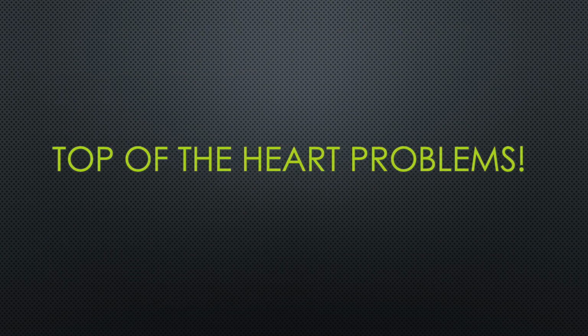All right, so we've talked about most of the normal and the sinus rhythms, so let's start talking about the difference between a top of the heart problem and a bottom of the heart problem. Remember that when we're looking at a rhythm, there are P waves and then there are QRSs. The P wave tells us when the top of the heart is squeezing, whereas the QRS tells us when the bottom of the heart is squeezing.